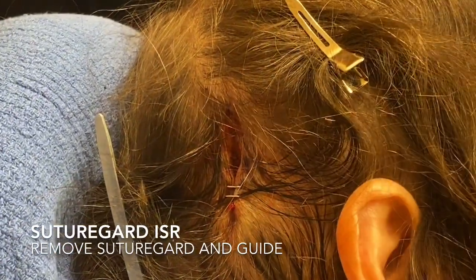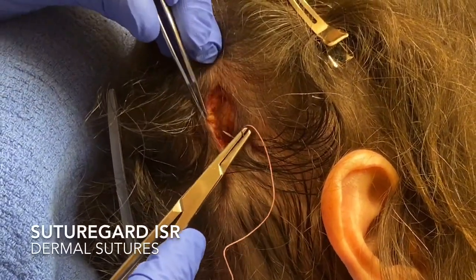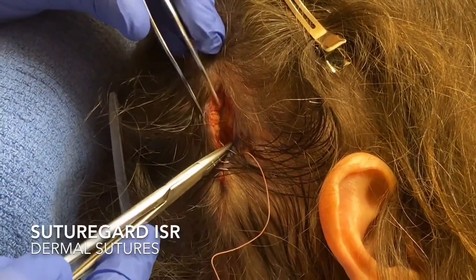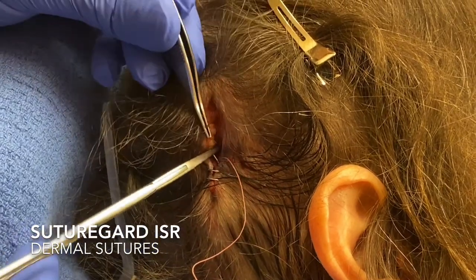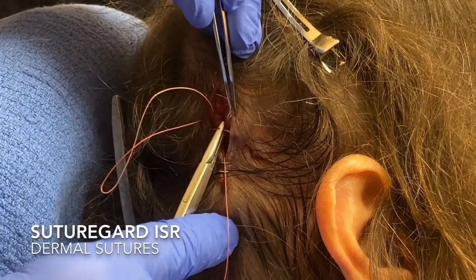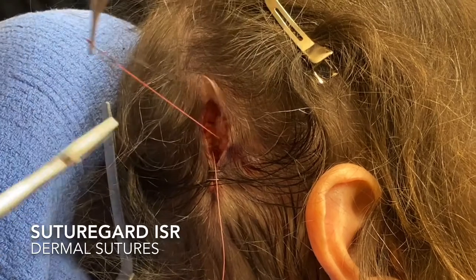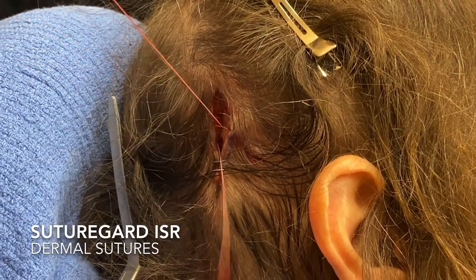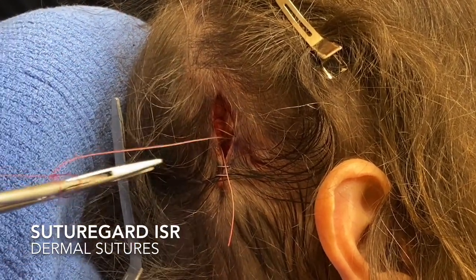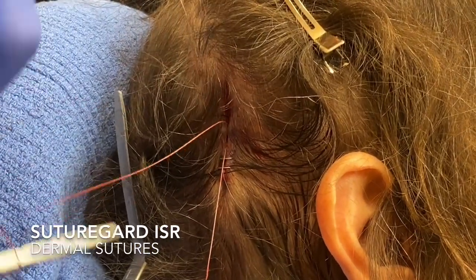Then I'll put in my dermal sutures. Here I'm just going to use a 3.0 polysorb with an interrupted pattern — I could also use a barbed suture if I wanted. I'll put in as many deeps as I think I need for the layered closure. You can see how the wound is already looking pretty good with a very minimal number of sutures and staples.